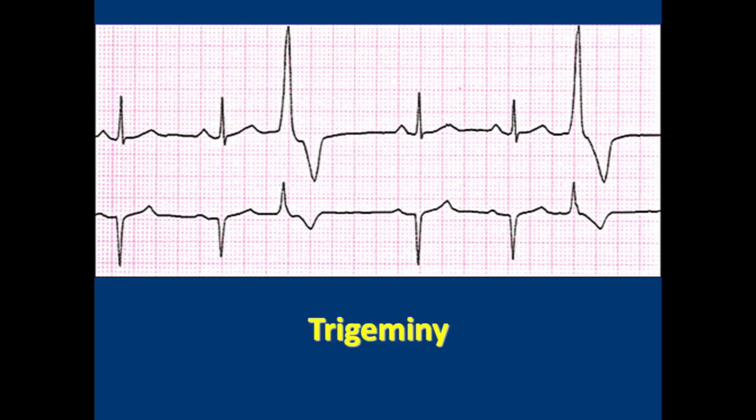That's going to be trigeminy. So it's a PVC and it's regularly on the 3rd wave. If you had marked down PVC on an exam, I would have given it to you. But if you mark down that it's trigeminy, that's even better.